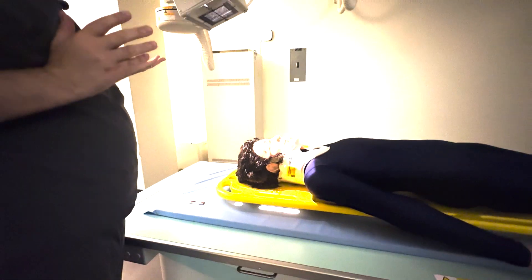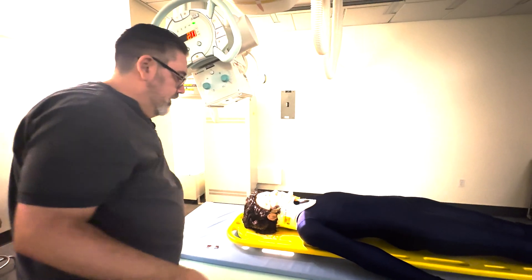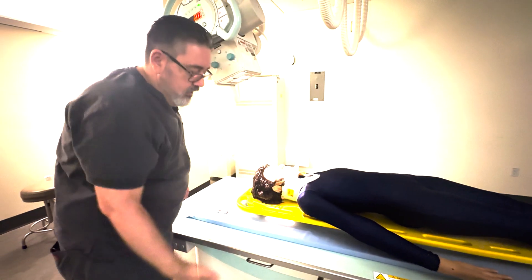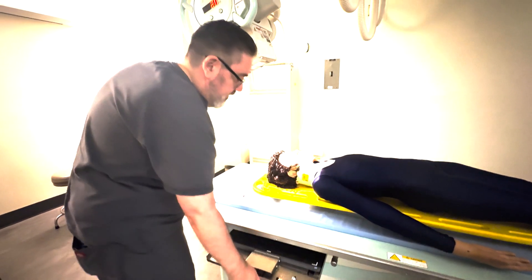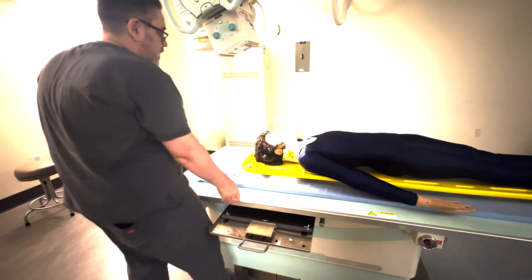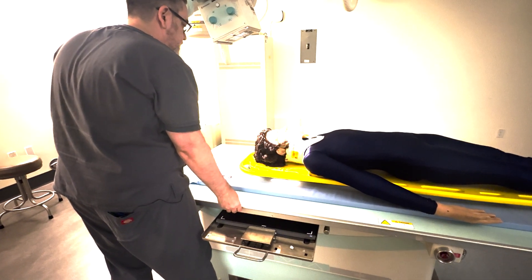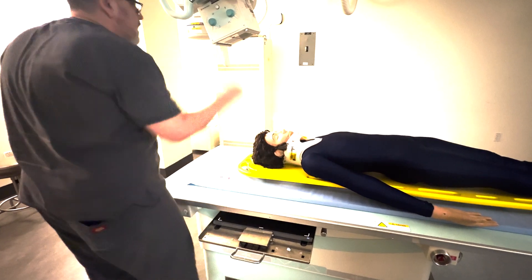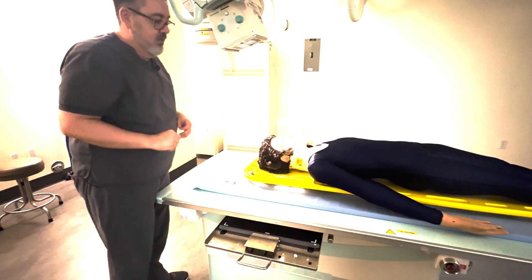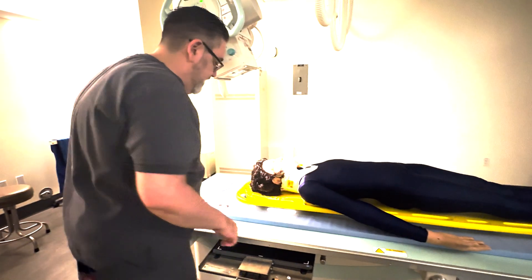Now that I have that angle, all I need to do is center and make sure my Bucky's lined up — whether you're using a portable cassette under the backboard or the Bucky here, you can use either. Remember, the central ray is the nasion for this view. Even if there's a little bit of rotation or tilt, we're not touching that. This is trauma, so we're going to leave it alone.